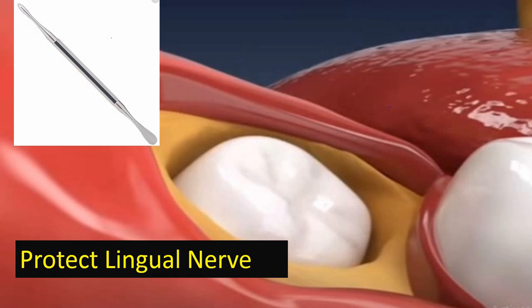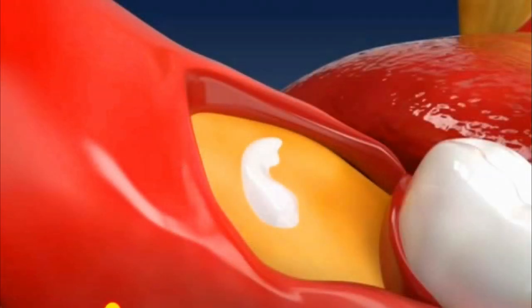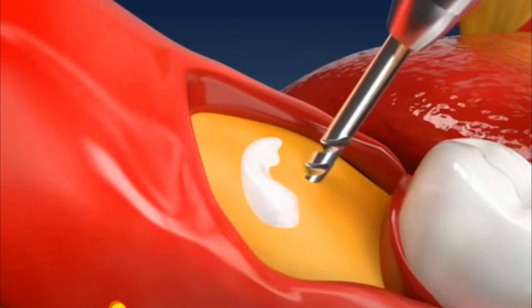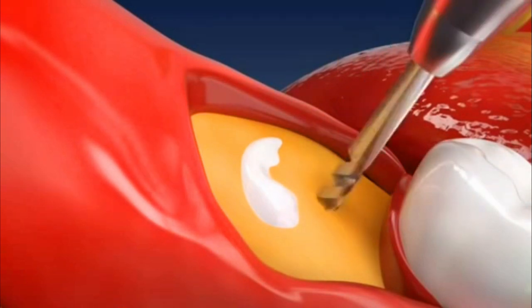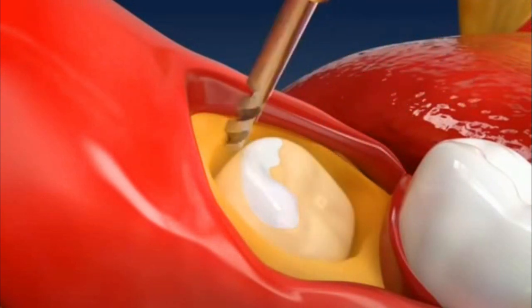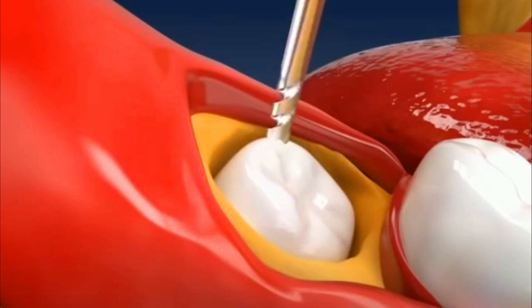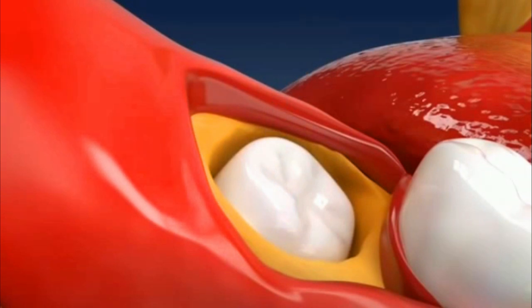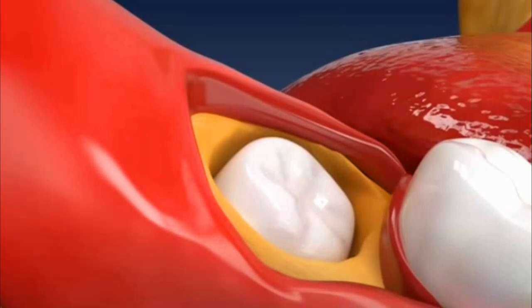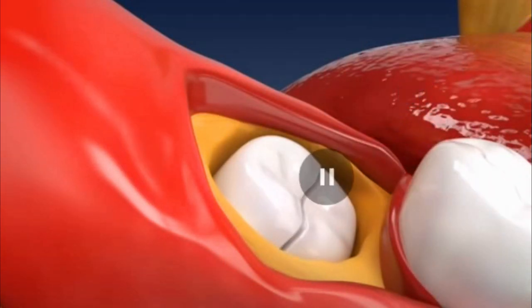A periosteal elevator is used to raise the mucoperiosteal flap. The lingual flap is raised a little to protect the lingual nerve. Bone removal is then done — the wisdom tooth is uncovered using a bur and surgical motor. Buccal and distal bone is removed to expose the crown and upper one-third of the root. Good irrigation with normal saline is required during bone removal.